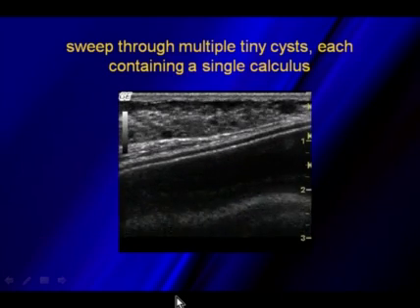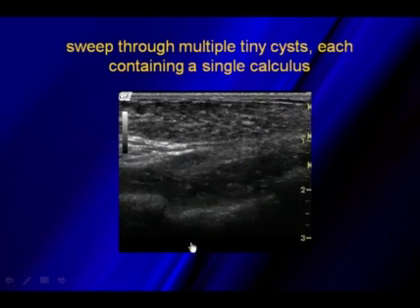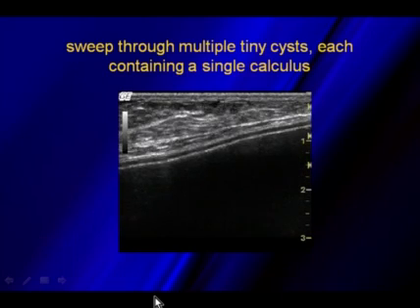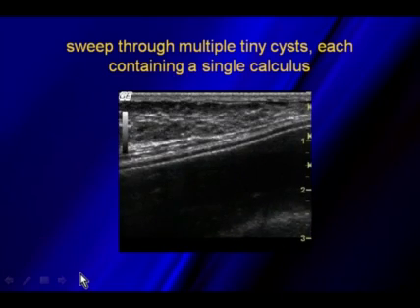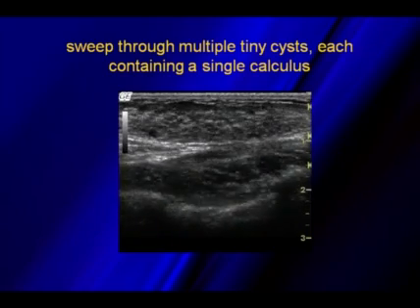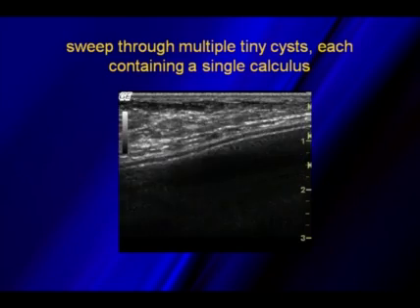Taking a cine loop clip, you can notice on this sweep through that in every little cyst we see a tiny little milk of calcium inside the walls of these cysts. So it answered our question on ultrasound. As you can see inside all of this fibrocystic change, almost a Swiss cheese appearance to the breast, there are milk of calcium located inside the cysts on this patient.